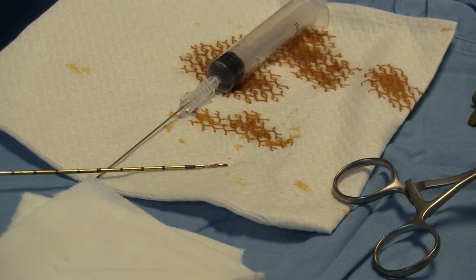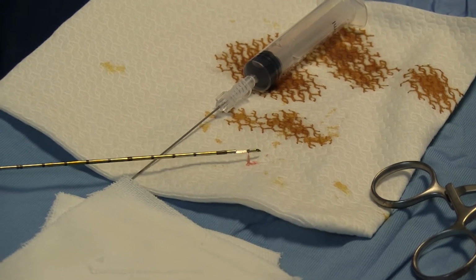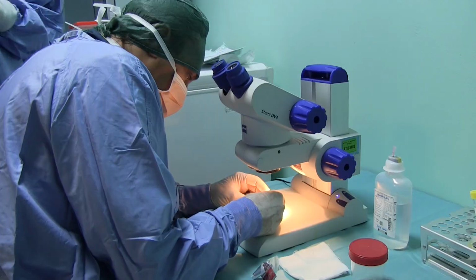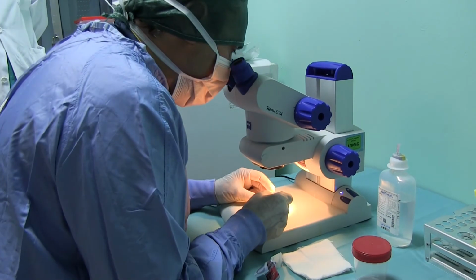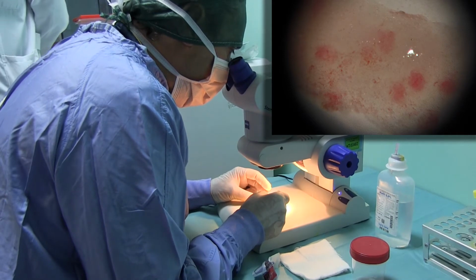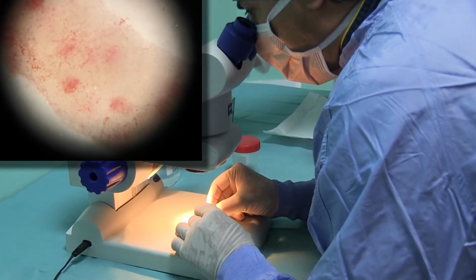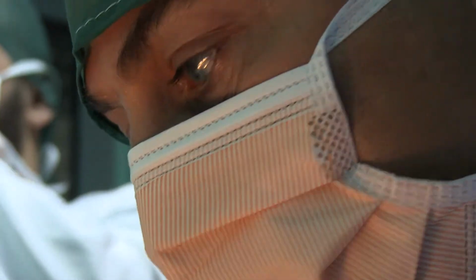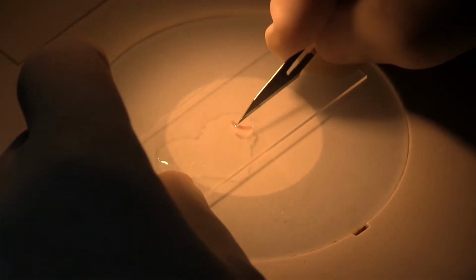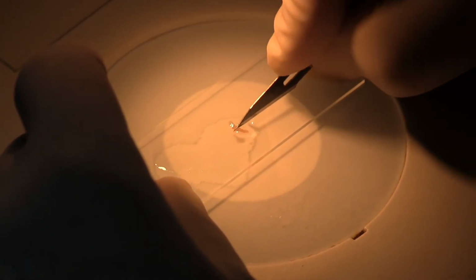Once the needle of the kidney biopsy is removed, advancing the central part of the needle reveals the core biopsy. The cores, which are usually obtained after renal biopsy, are about 2 centimeters long. This core must be observed with a stereomicroscope to evaluate its adequacy, which is linked to the presence of glomeruli.